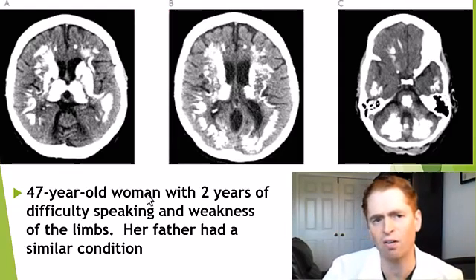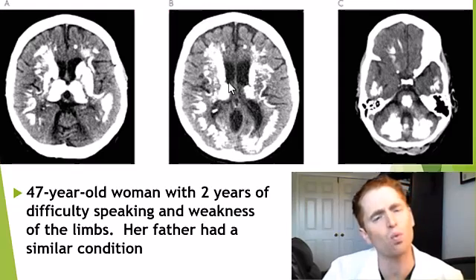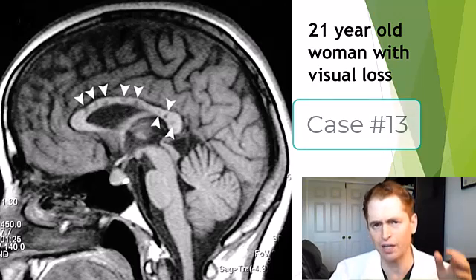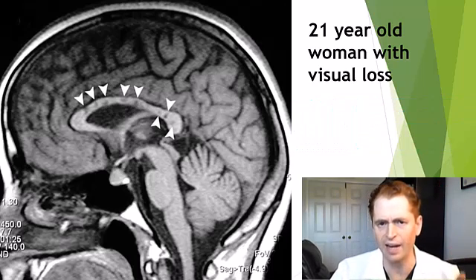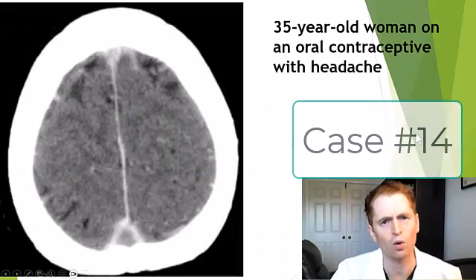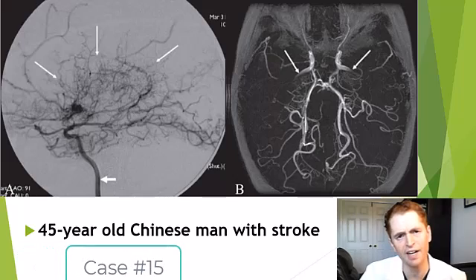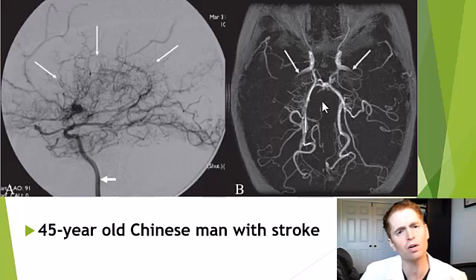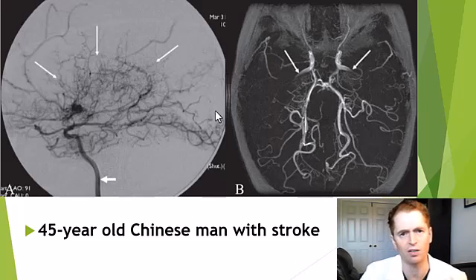It doesn't take eagle eyes to see the abnormalities, but what is the diagnosis? A 21-year-old woman with vision loss — this is a sagittal T1 MRI with no contrast dye given. A 35-year-old woman on oral contraceptives with headache. A 45-year-old Chinese man with stroke: on the left, a catheter angiogram; on the right, an MR angiogram with reconstructions. Bonus points if you can name the two different findings shown by the arrows in these images.